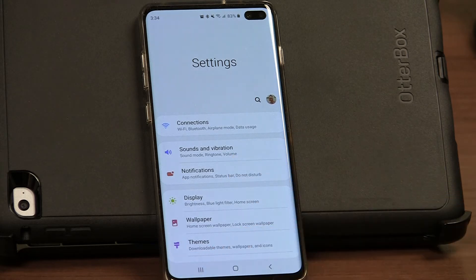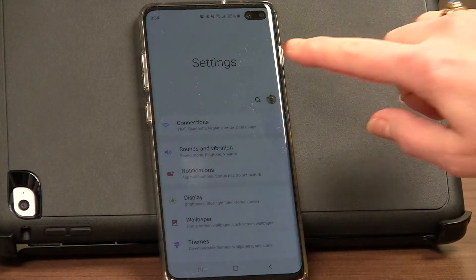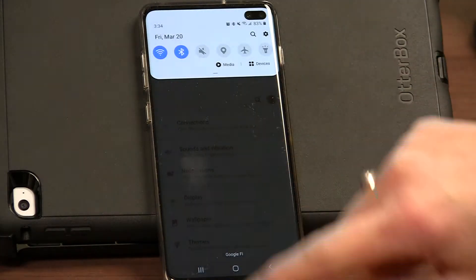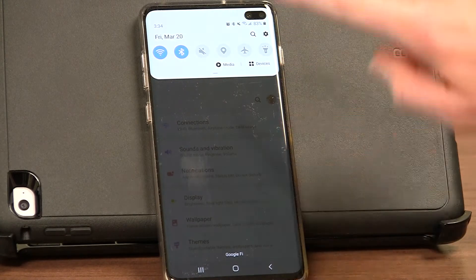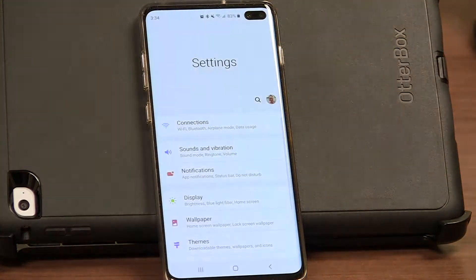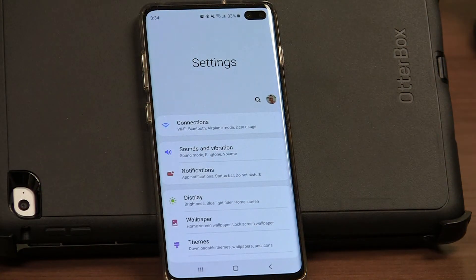The first thing we're going to do on your phone is go to the settings screen. Everybody's settings is located somewhere different depending on their phone, but a lot of times you can swipe from the top or the bottom and find the little gear icon, which will take you to the settings screen. And that's where I am now.